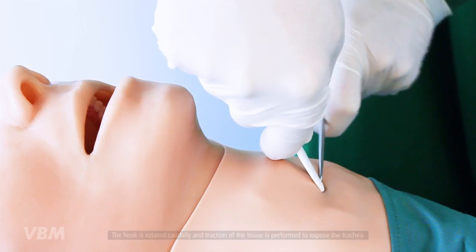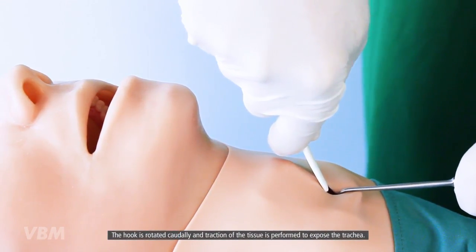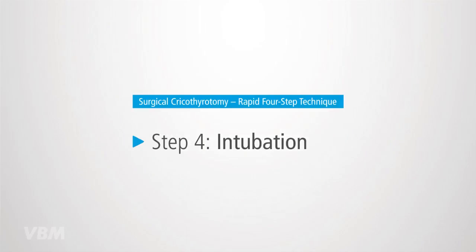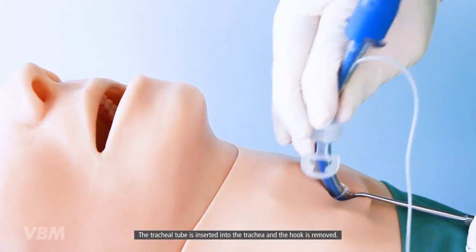The hook is rotated caudally and traction of the tissue is performed to expose the trachea. The tracheal tube is then inserted into the trachea and the hook is removed.